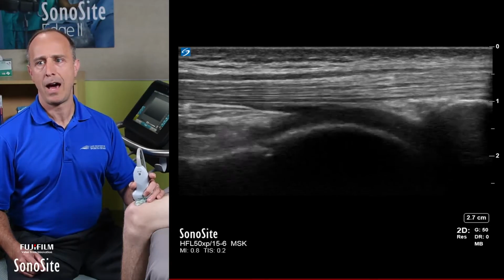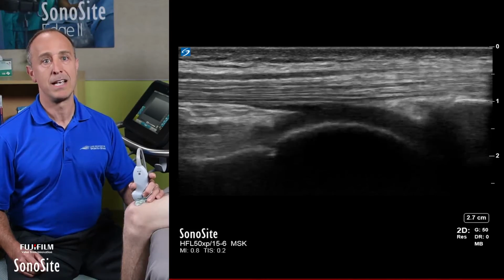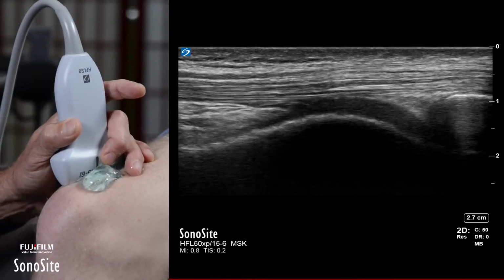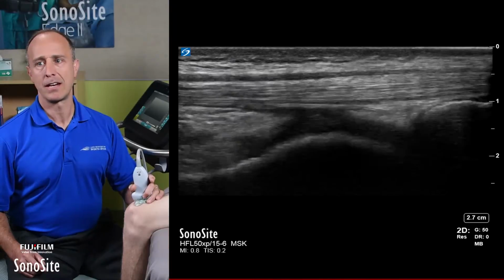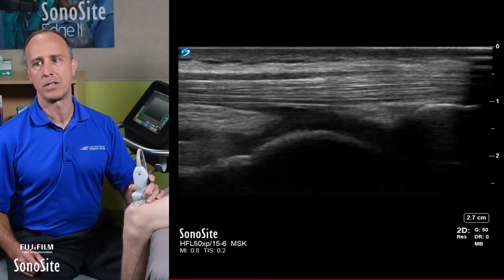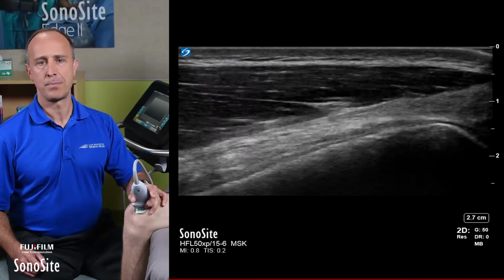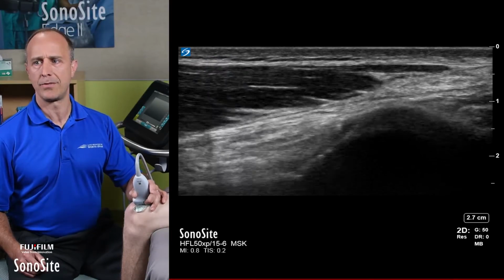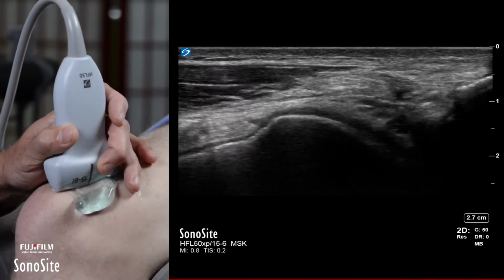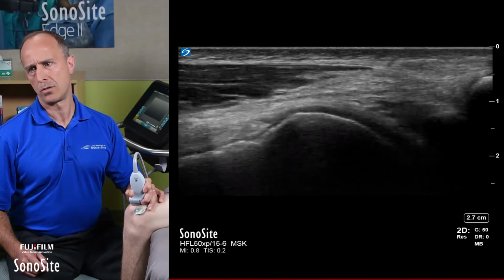So now I'm going to come back to the center view, where if I now compress up and down, I can see that small effusion displacing, but what doesn't displace is the anechoic hyaline cartilage. Another structure that is displacing, in addition to that effusion, is the fat pad. Okay, so I can displace that with this pressure. I'll roll now to the opposite side of the knee just to look at the cartilage overlying the lateral femoral condyle. And so I have to tilt the transducer to try and tune that in.